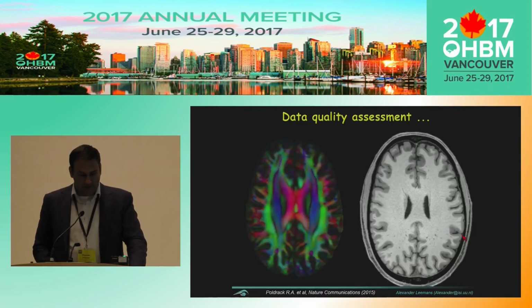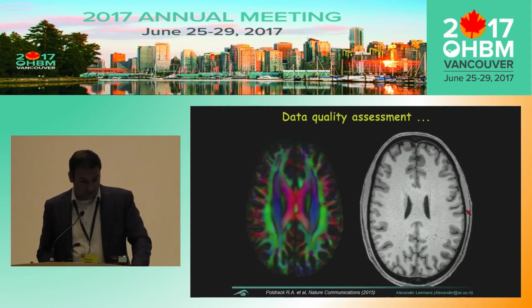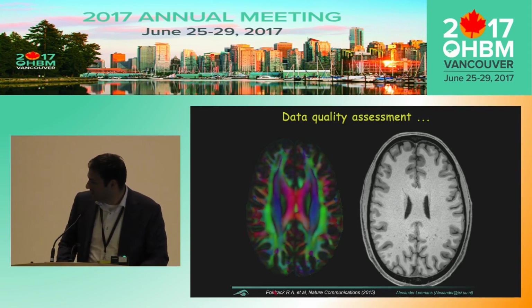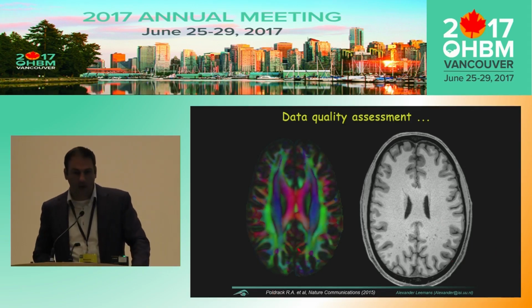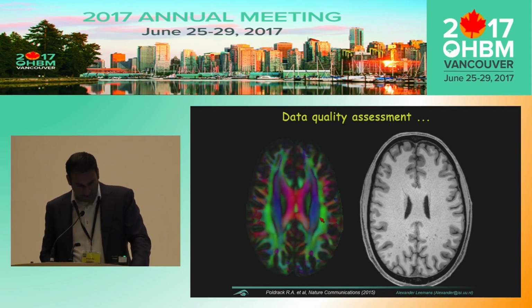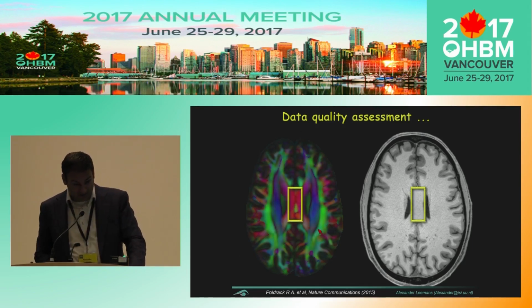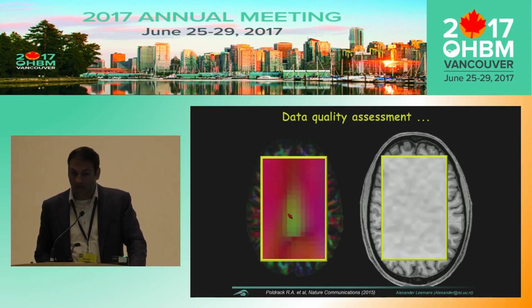Okay, and this is an example that actually drives this point home. If you look at this example over here, this is high quality data. As you can see, it was actually acquired by a team of Russ Poldrack, so it's about MyConnectome, you may have heard of this. Basically, Russ scanned his brain for, I think, more than a year, a lot of data. And then at some point he asked me to analyze his diffusion data. So I looked at his data, and indeed in this region, something funny popped up, right?